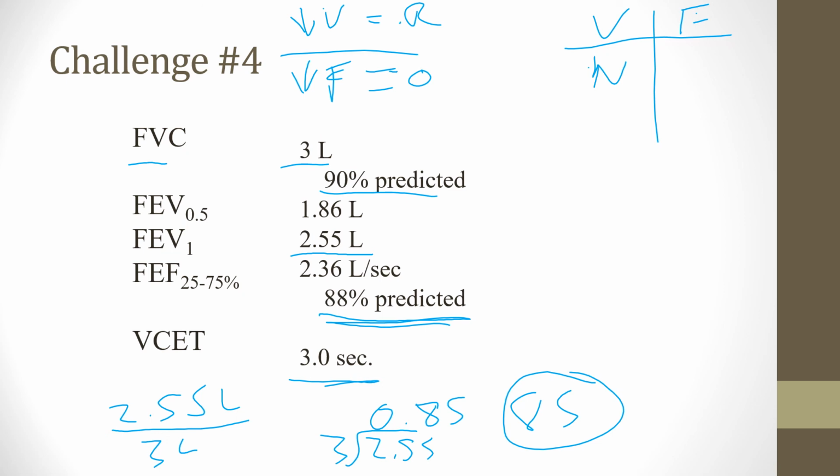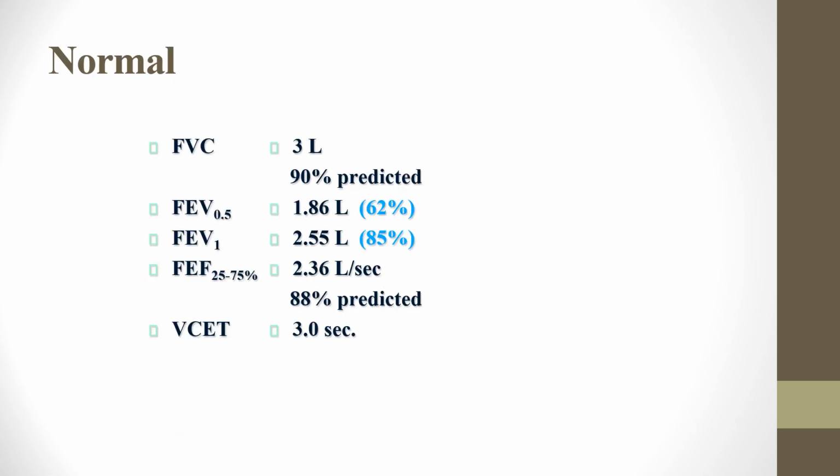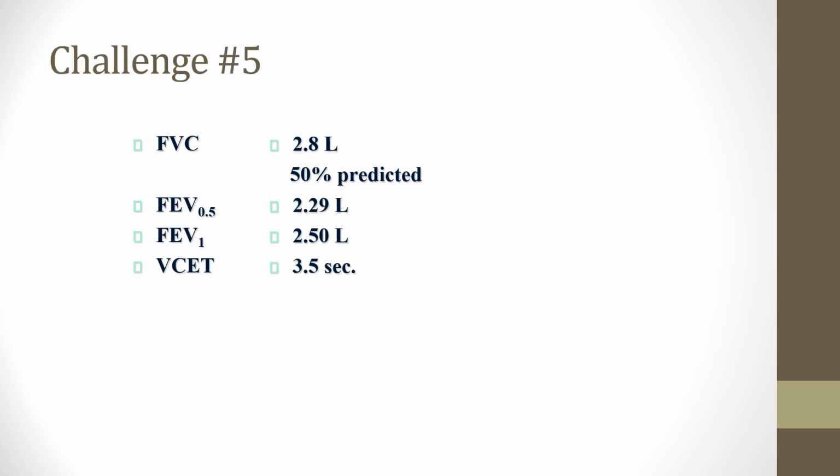What's a normal? 75 to 85%. So our flow rate's normal. So my volume's normal. My flow rate's normal. So in this case, everything here is normal. So hopefully you can see I might ask you something where you might actually have to remember that there's a calculation and what goes into it and why that calculation is so key. That's the big one that we focus on, the FEV1%. Okay, let's do another example problem. Love them.